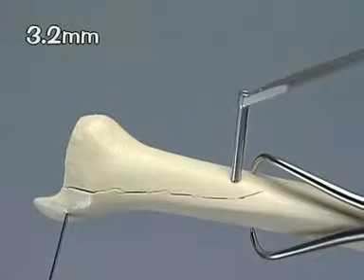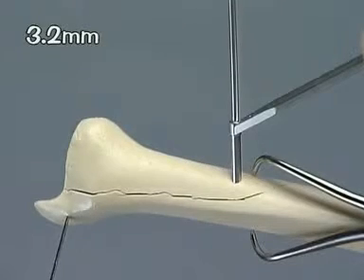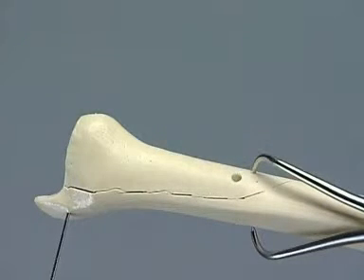Insert the 3.2 millimeter drill sleeve and drill the thread hole in the opposite cortex with the 3.2 millimeter drill bit. Countersink for the screw head.